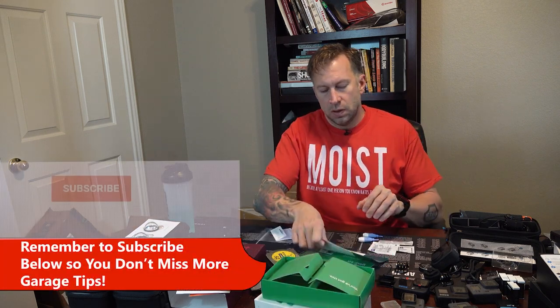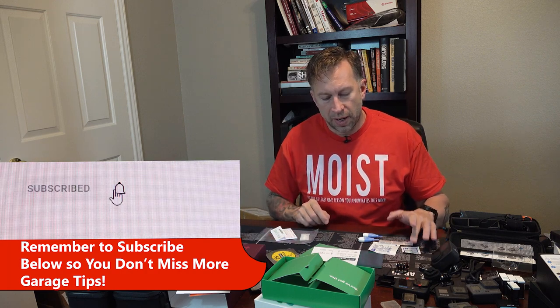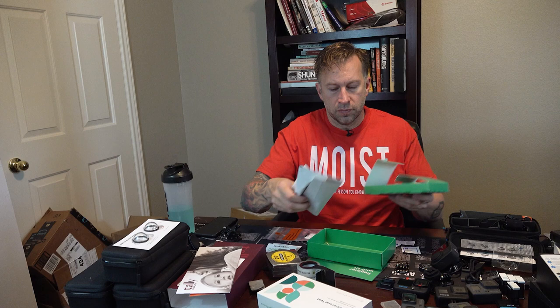Pull everything out. As the instructions say, you've got your alcohol prep pad, you've got the collection card, you've got a couple of lancets, you've got a band-aid, biohazard bag, gauze pad, and hiding in the bottom of the package is your return envelope and shipping label. So you have all that set so that it'll go right back where it needs.